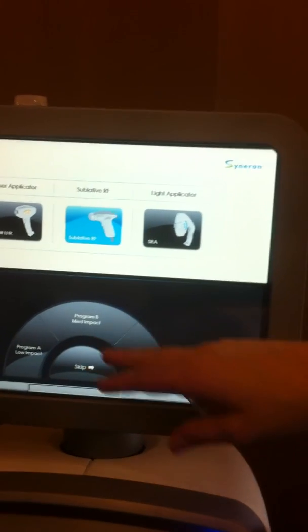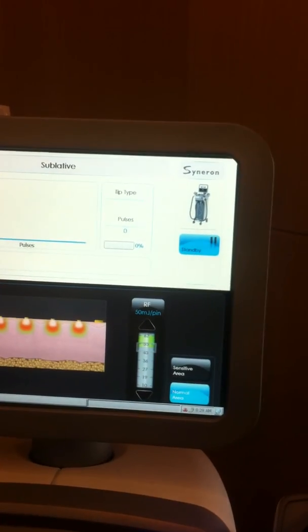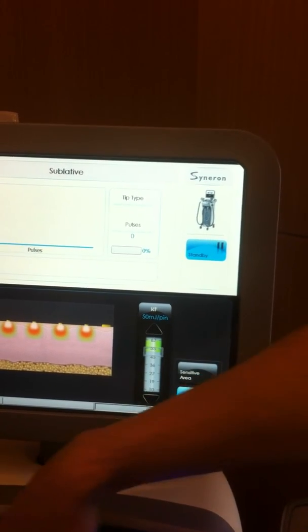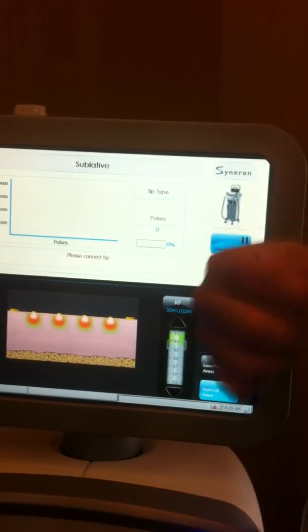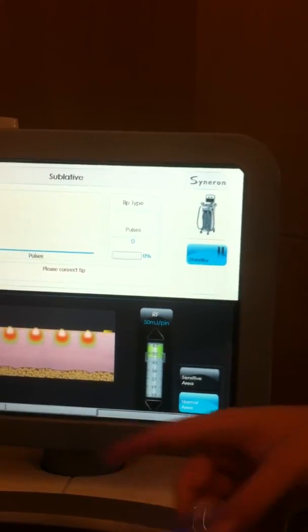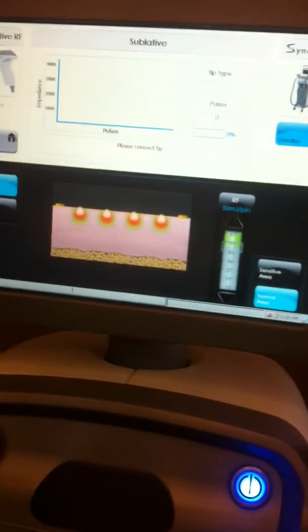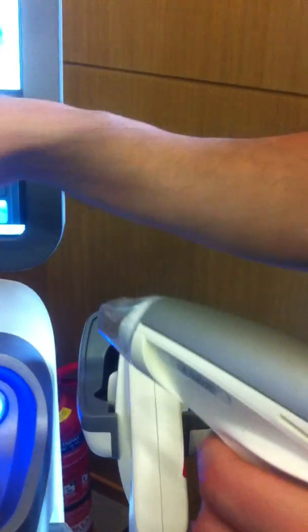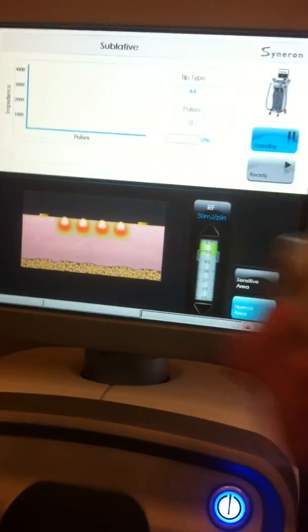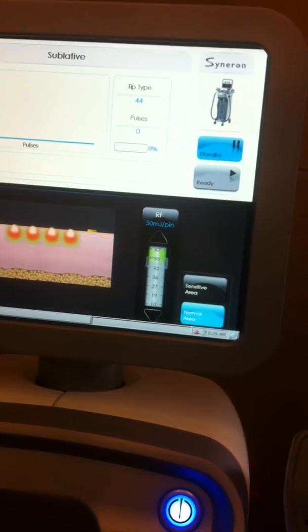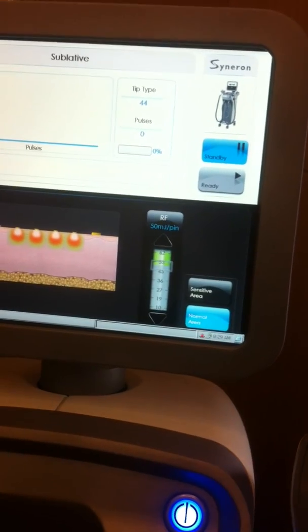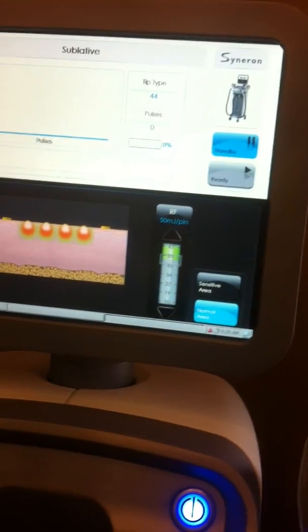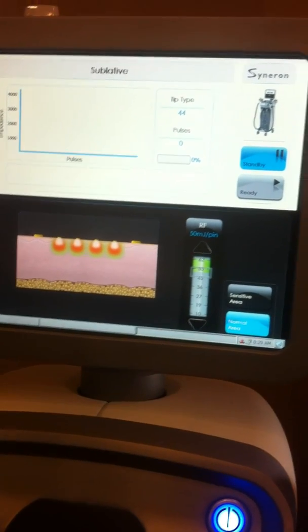Now, I'll click on sublated. This is a gel holder, by the way. It can hold two bottles of gel. So you can see right now, this is the 64 configuration. It says it asked me to connect the tip. Did you notice the change? You see that now it's dense, because this is one millimeter spacing. So this is the density of the HD tip. And you'll see that the area got smaller too. So everything's scaled on this.